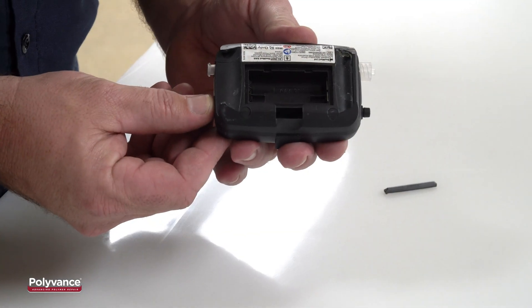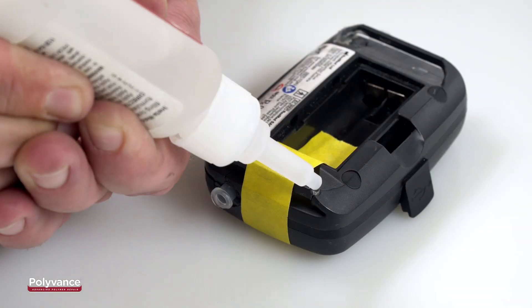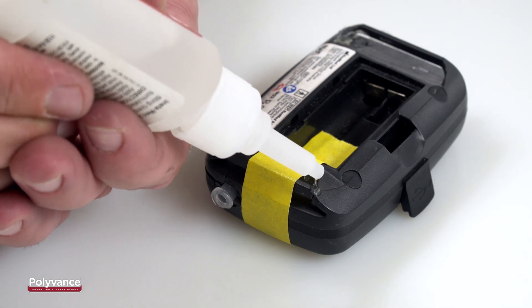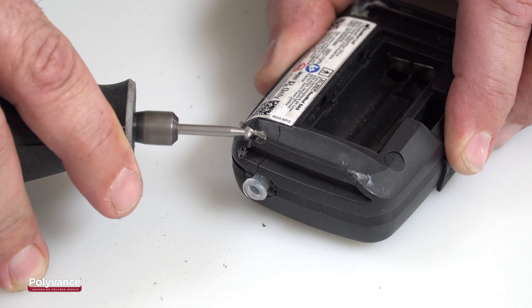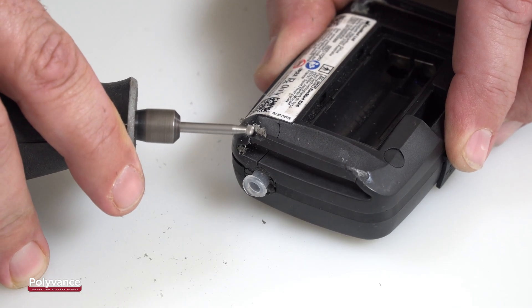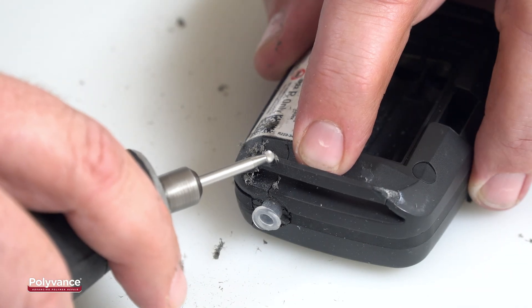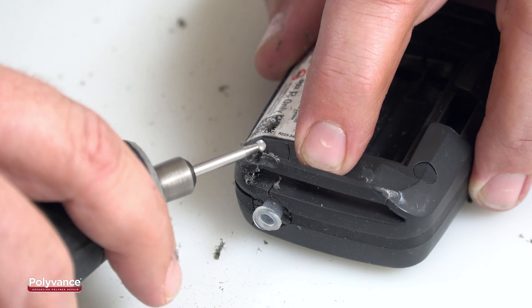This Sleep Apnea Monitor has a broken strap guide on one side. First, we'll use some superglue to temporarily hold the guide back in position. After the glue hardens, use a small dremel tool to remove some of the plastic across the crack and along the guide. This will create a space for the PlastiFix adhesive to remain after the repair has been sanded smooth.